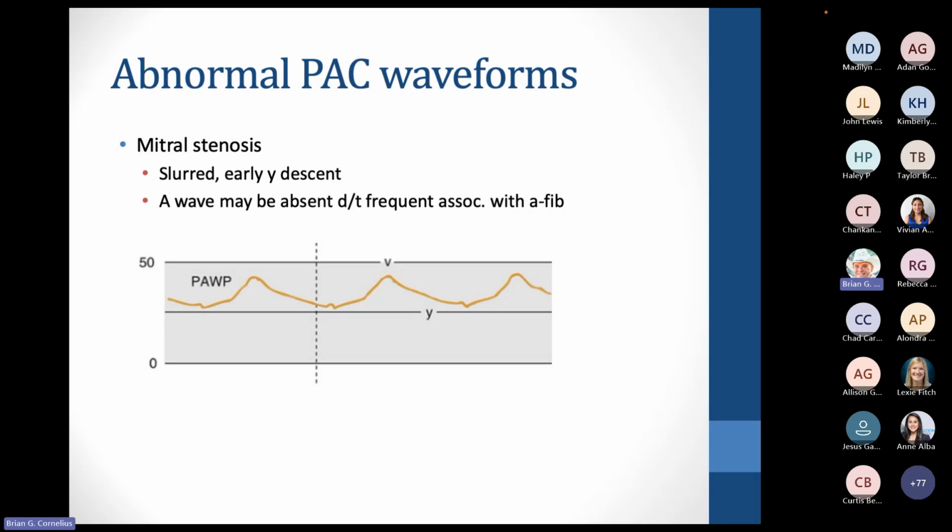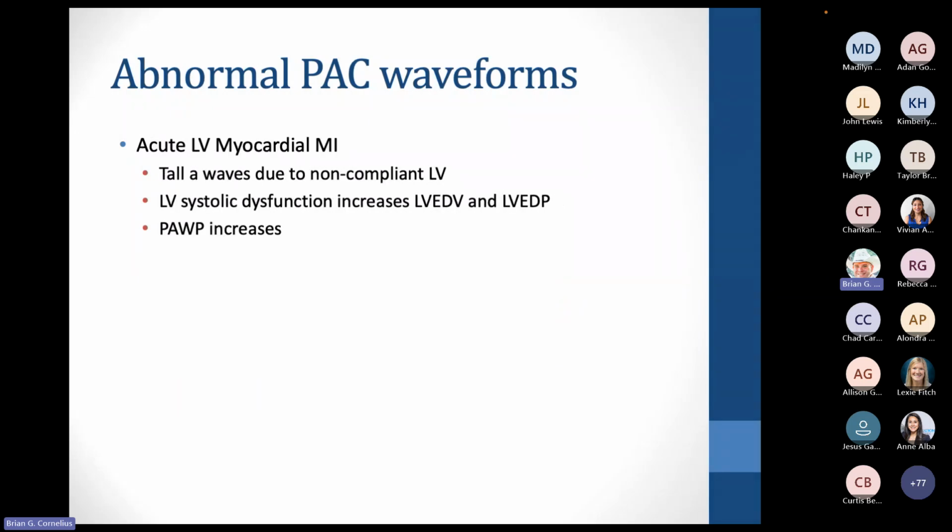The cool thing is, since they are in the chest, usually they can just look at the heart and tell what the rhythm is without even looking at the EKG, because they are observing how the heart's contracting. So if you've got somebody that's in AFib or VFib, it's pretty easy to see from the outside.